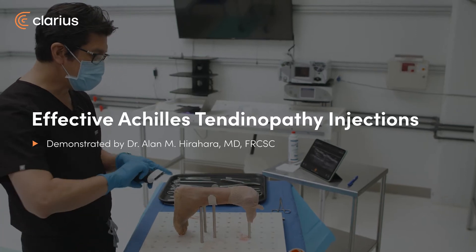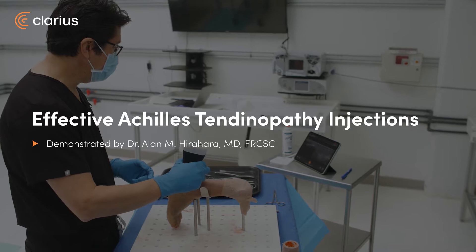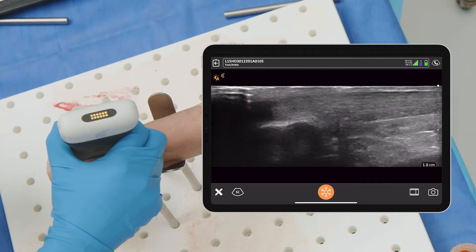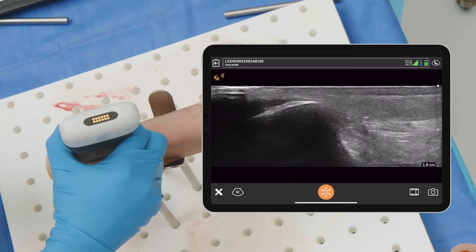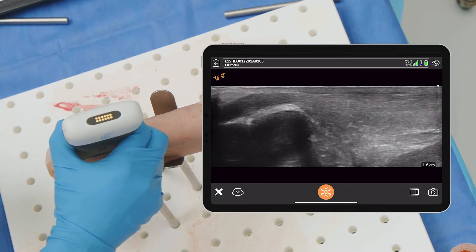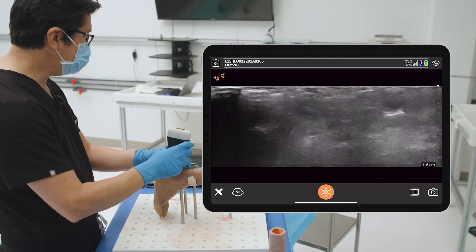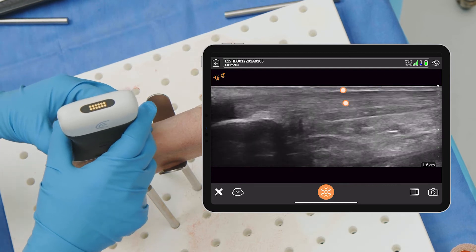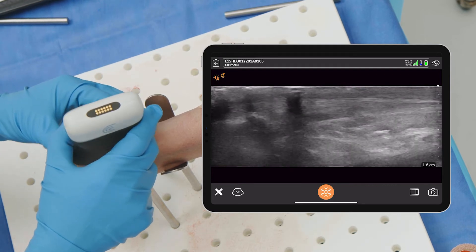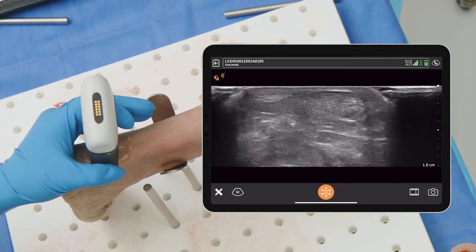I've done a fair amount of Achilles injections for tendinopathy. It's something that's fairly common in athletics. One of the biggest issues I've personally found is how to do the best injection for these. I personally at this point really like the short axis in-plane. You can see it really nicely in-plane, but unfortunately it's very superficial, so it can be harder to get in-plane long axis injections. I do like the short axis for finding your tendinopathy area.